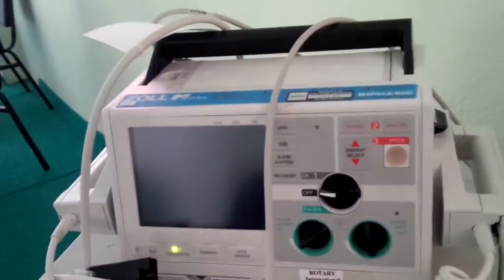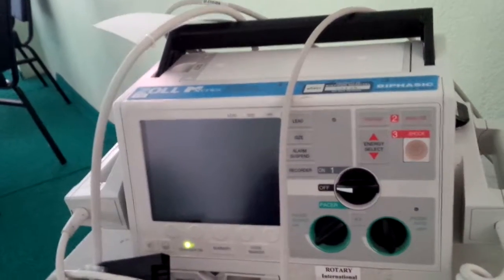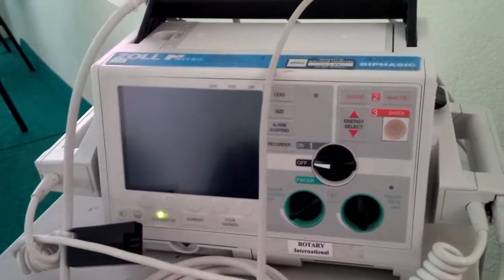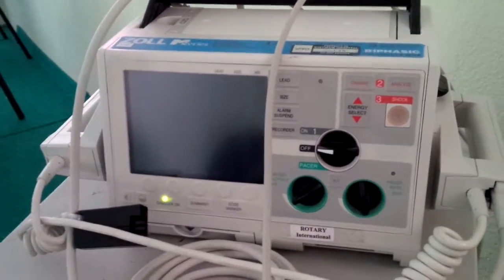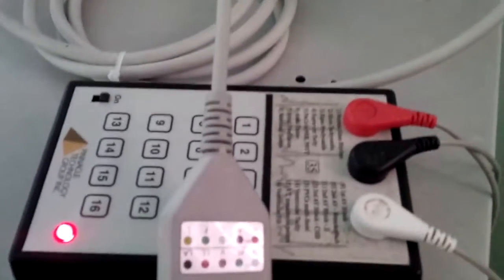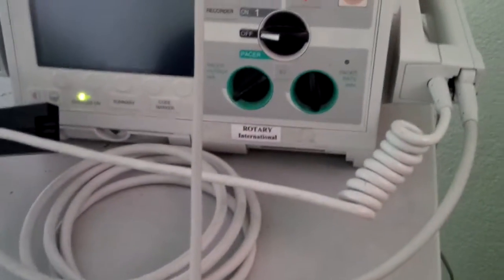Hi, this is Joe, and I'm having an intimate moment alone with the Zoll M-Series defibrillator pacer AED. I've got my trusty AT35 rhythm pulse generator here, and I'm just going over the steps of how to use this thing.